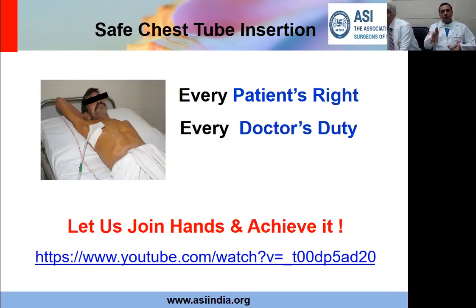But certainly, if you have a chest x-ray showing that the lung is still reaching up to the chest wall and you feel that lung could be adherent there, then there is no harm in putting the finger and doing some maneuver. Two things I have against putting a finger. One is, it will necessarily need a hole bigger than the chest tube. That's one. And two, I have found this to be extremely painful.